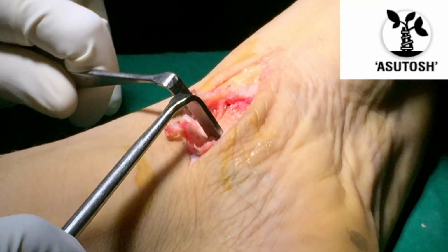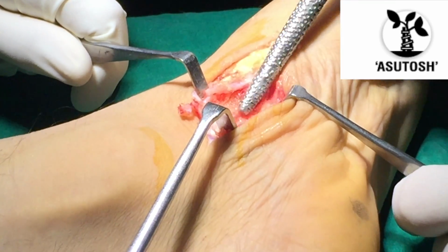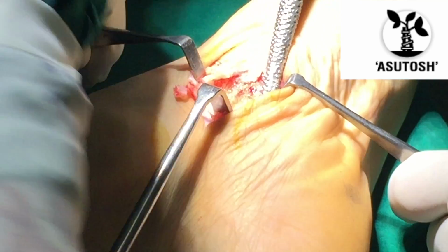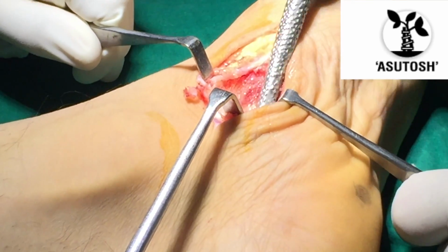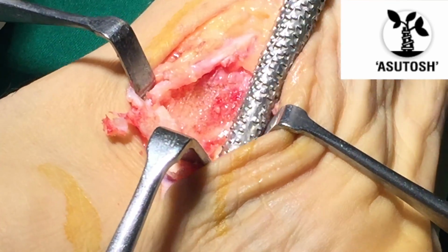With the help of the rasp, we are smoothening the roughened edges so that it may not cause pain later. And then later we digitally palpate to see if the roughened edges are removed.